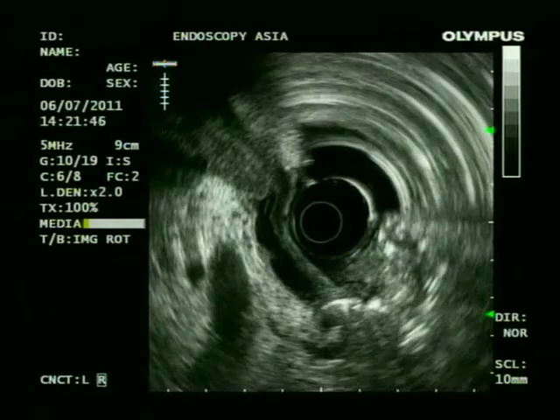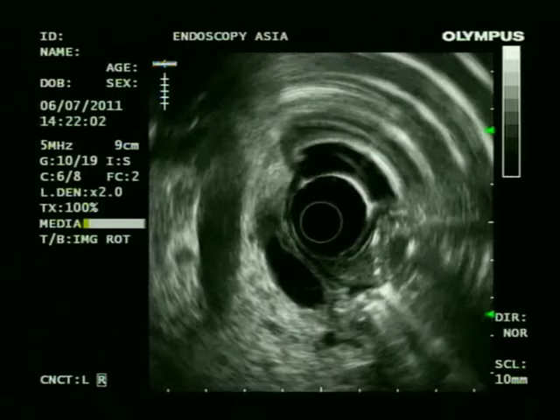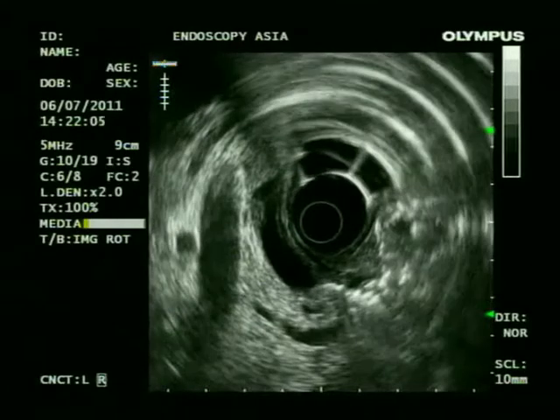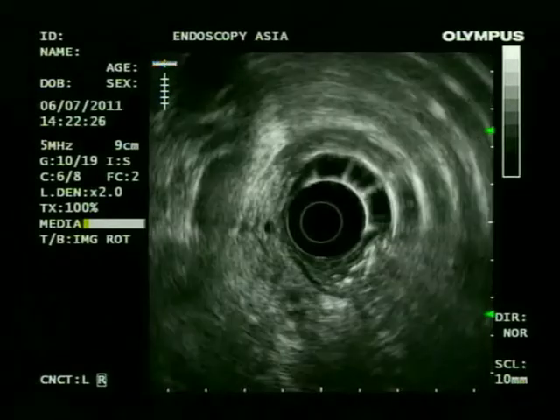Here we can see the bile duct coming down. There is a mass lesion in the upper CBD region. That's a portal vein. You can see the hepatic artery, the pancreatic duct coming into the ampulla of Vater.